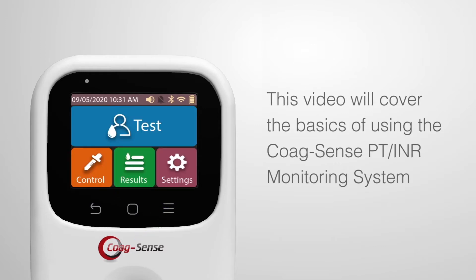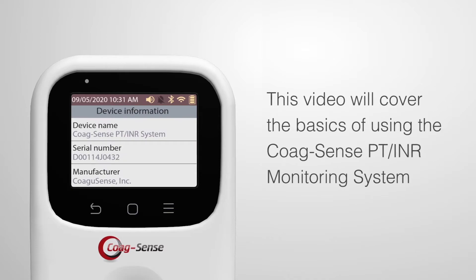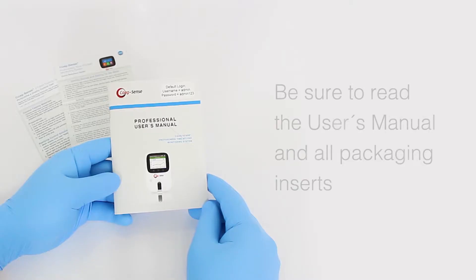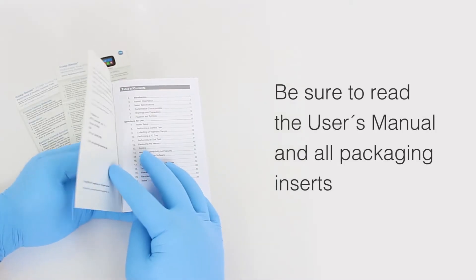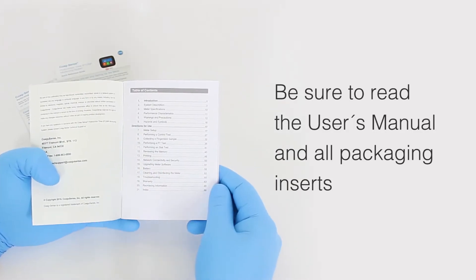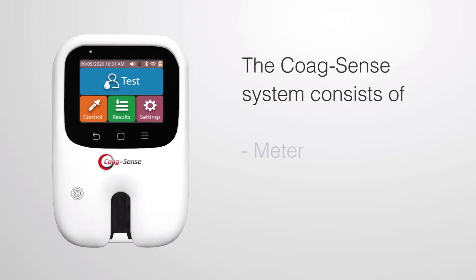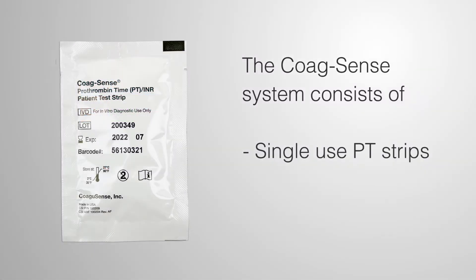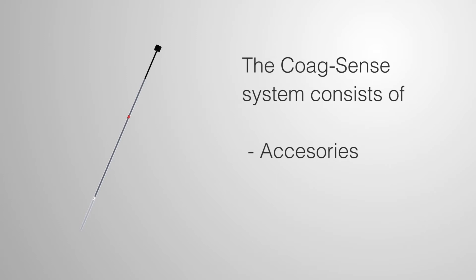This video will cover the basics of using the CoagSense PT-INR Monitoring System. For complete instructions, be sure to read the user manual and all packaging inserts. The CoagSense system consists of a meter, single-use PT strips, control strips, and certain accessories required for testing.